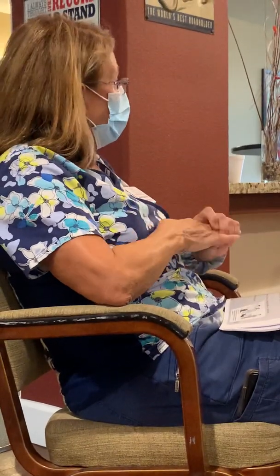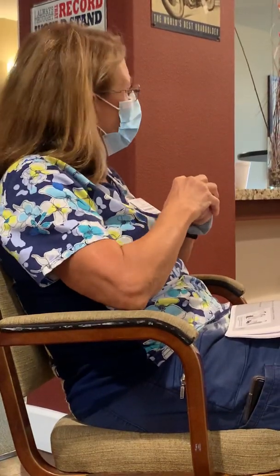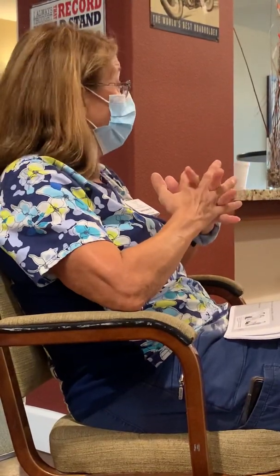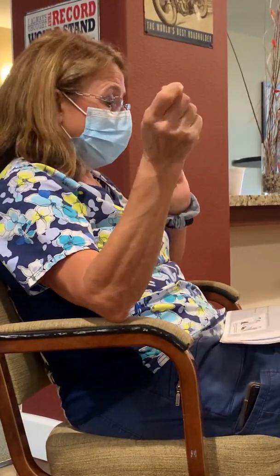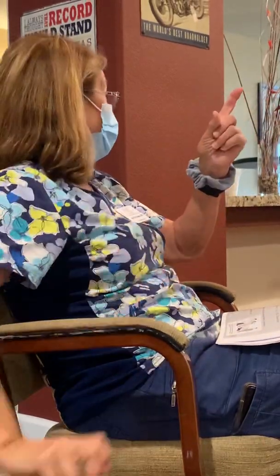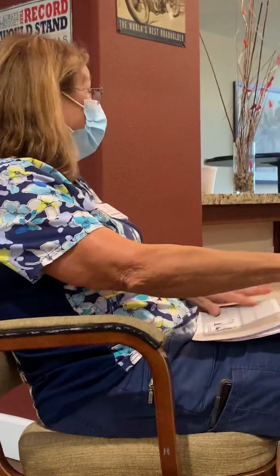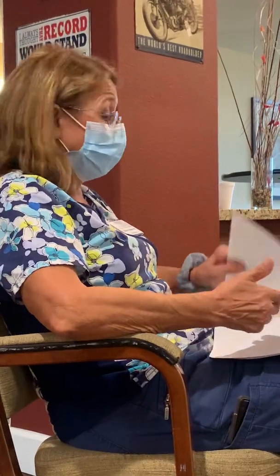And then you're going to use a clean washcloth, soap, and water. If your soap is really strong or your patient has really sensitive skin, go ahead and dilute that soap a little bit. It is okay. Then you're going to clean the catheter, starting at the catheter where it enters the body, down towards the drainage tube in a circular motion for at least 4 inches. So you're going to go down quite a ways. You don't have to clean the whole tubing down, but you do need to clean down. Okay? And then of course you're going to document it. You have to document it, because if you didn't document it, it didn't get done.